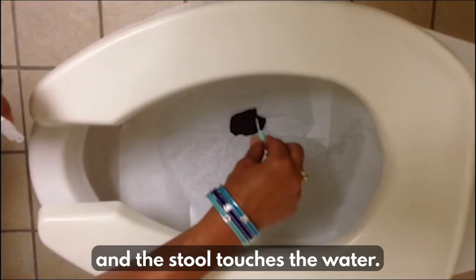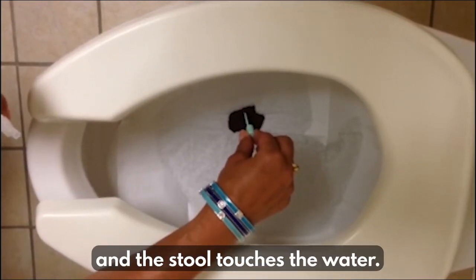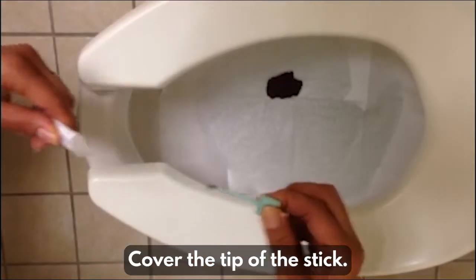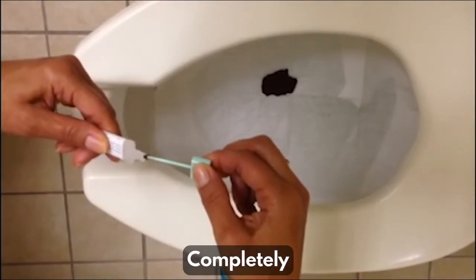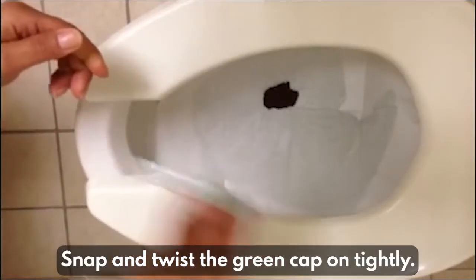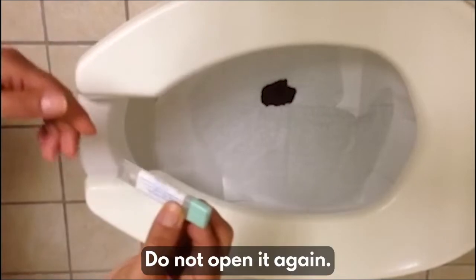Before the paper sinks and the stool touches the water, scrape the top of the stool using the stick that is on the cap. Cover the tip of the stick completely. Put the stick back inside the container. Snap and twist the green cap on tightly. Do not open it again.